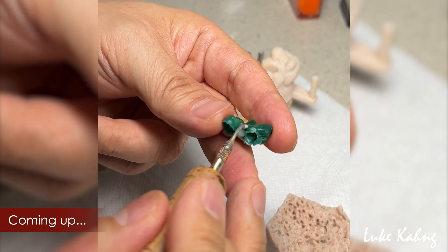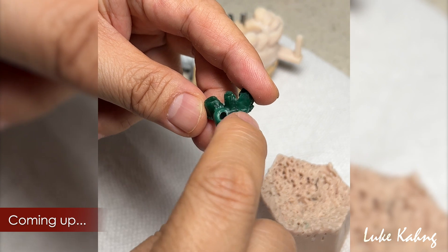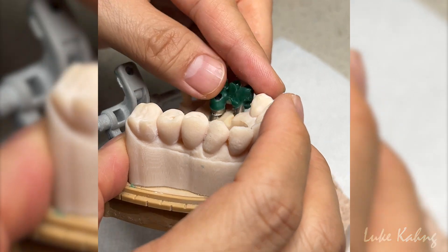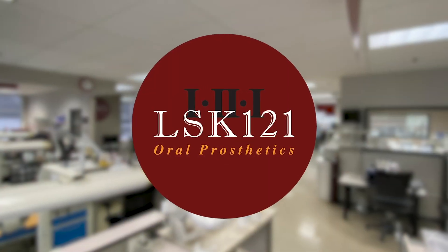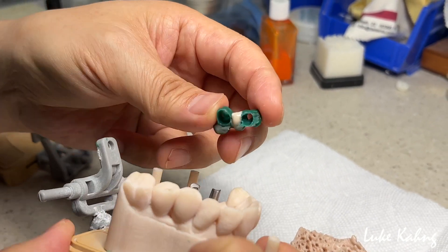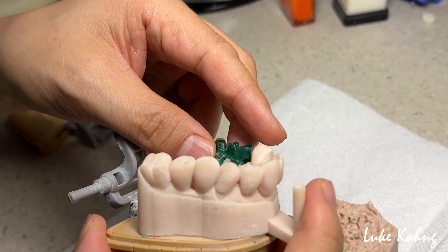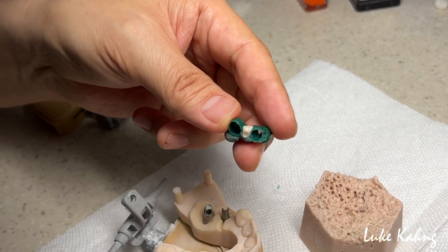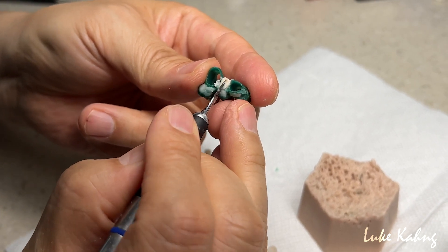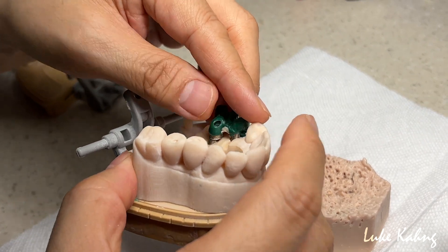Let's try to add it here. But the finish line will be this area. Alright, finish line is good. I'm going to cut it off — it's too much now, so I'm going to cut it just a little tiny bit, so then I can wrap it around.